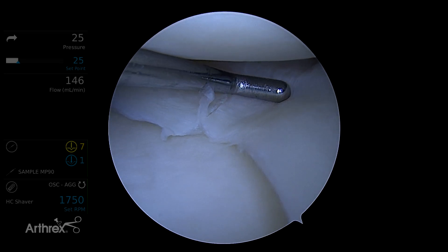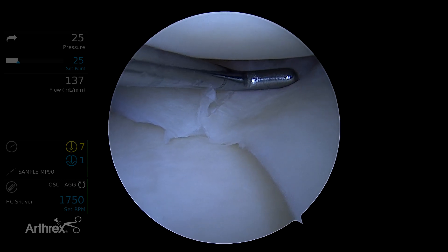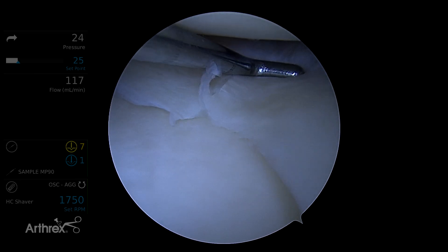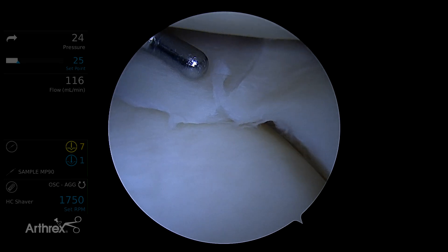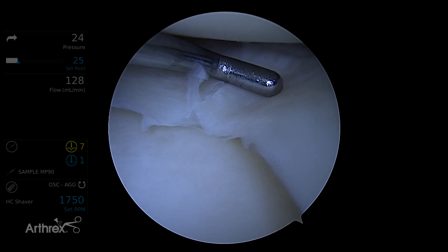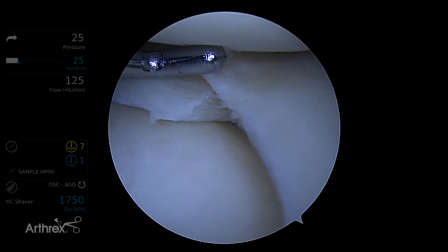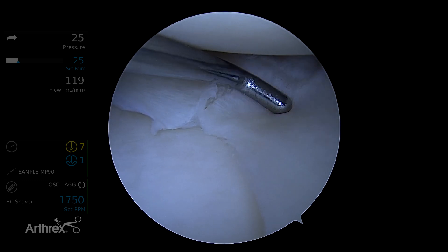Just because it tore there doesn't mean, like with a cuff, that the tissue right next to the tear isn't attenuated or injured as well. So we're going to talk about something new called a medial meniscal radial tear ripstop type repair. The ripstop is going to use a new fiber stitch — a vertical suture in each of the meniscal elements — to create a ripstop or reinforcement, and then we can bridge across those vertical sutures to take some of the tension off the actual tissue while getting good coaptation across the tear. This is a technique to decrease the tension through your stitches in the meniscus and take up the tension with your ripstop pre-placed vertical sutures.